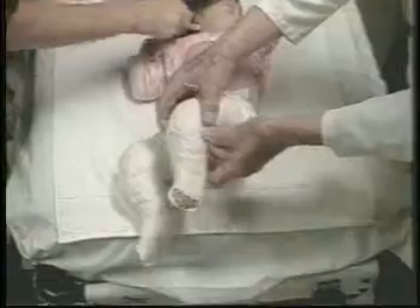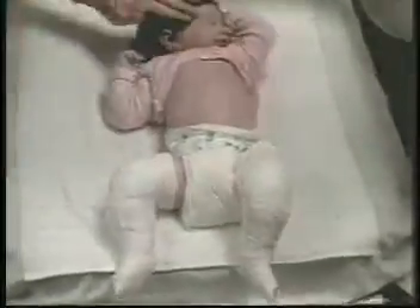Now, the baby is placed on the table. The plaster cast is applied while holding the forefoot in supination and abduction. The heel is well molded. In the finished second plaster cast, the forefeet are still kept in severe supination, needed to continue the correction of the cavus.